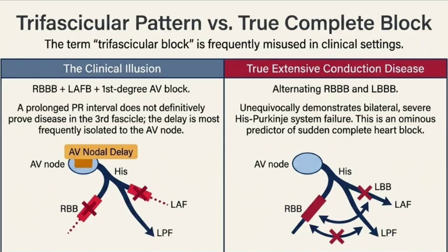And depending on which security camera you look through, you see a specific pattern. You see a small dip, then a big spike in the cameras looking at the side of the heart, and a small spike, then a deep dip in the cameras looking from the bottom. But trying to memorize those specific spikes and dips while a patient is crashing has got to be incredibly difficult. It is really stressful, yeah.